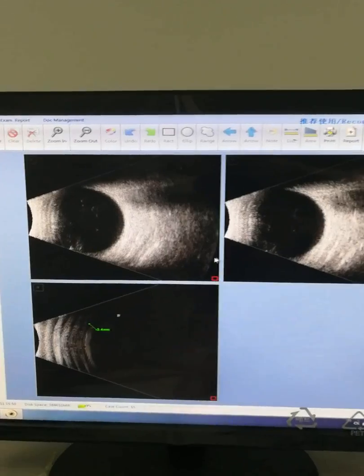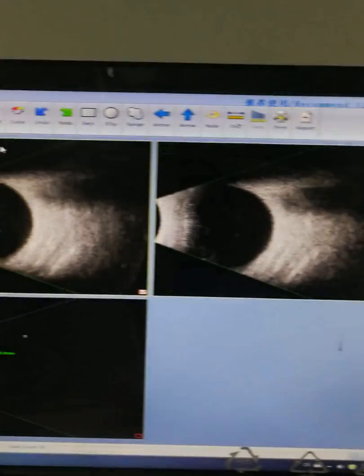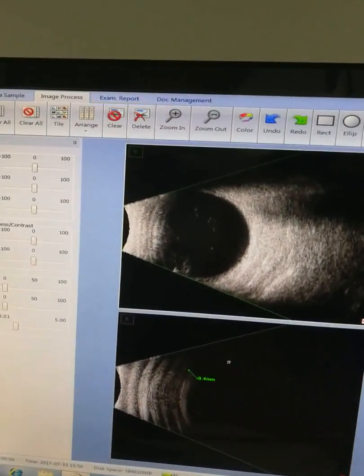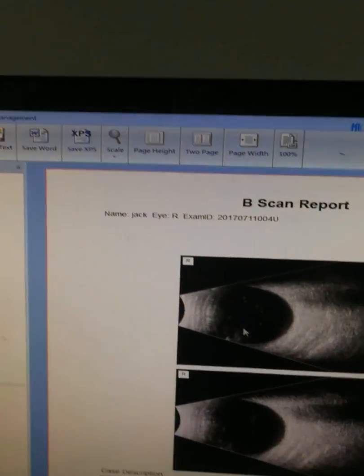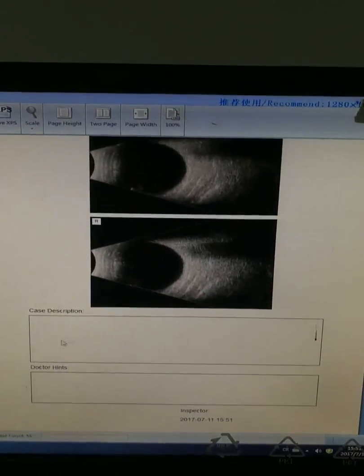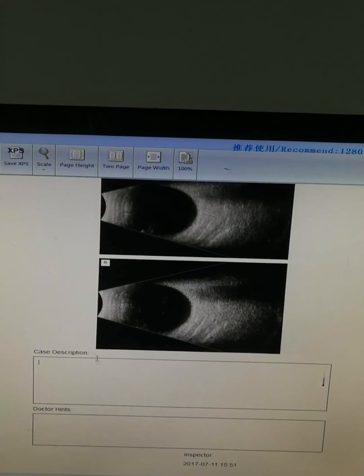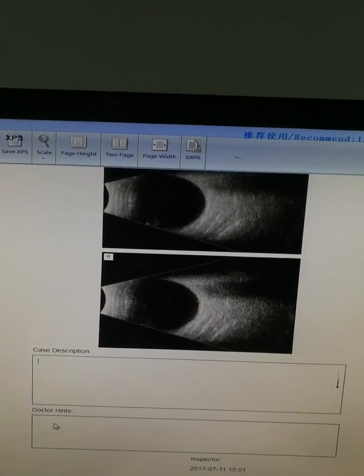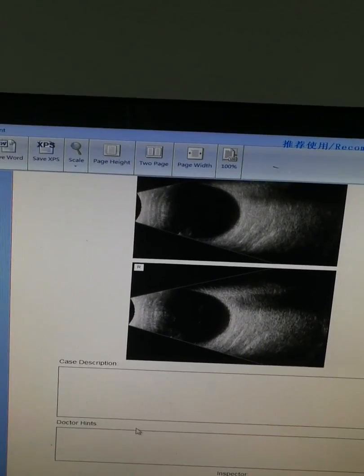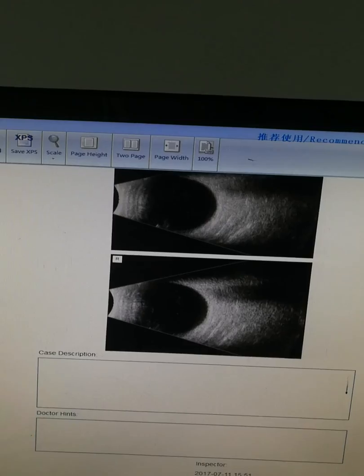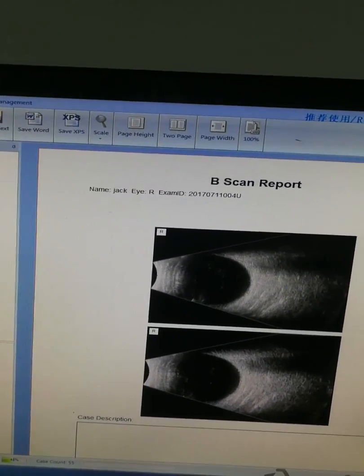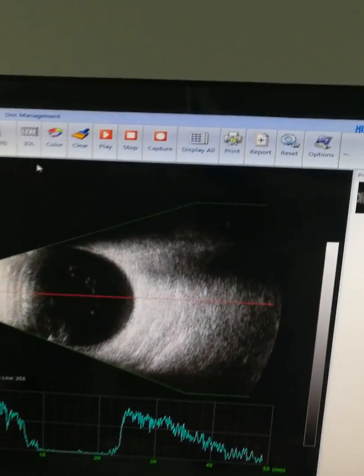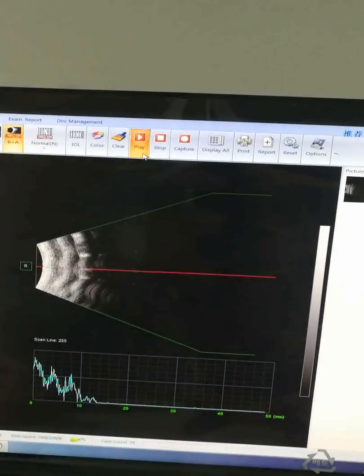You can choose the image you want to print. This is the report where you can input case description and the doctor's notes. This is the playback function. You can play back.